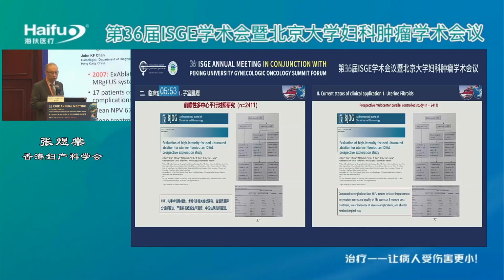For some reason, they stopped this treatment, probably because it is expensive, and also because the treatment time is very long. So I guess they stopped it. In fact, I don't know how long they worked, but they did it, and then they eventually stopped.